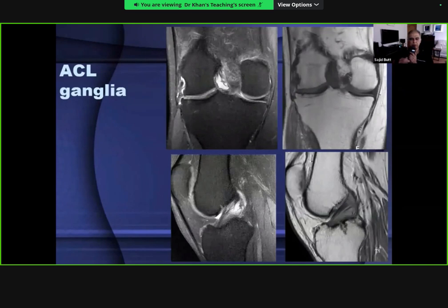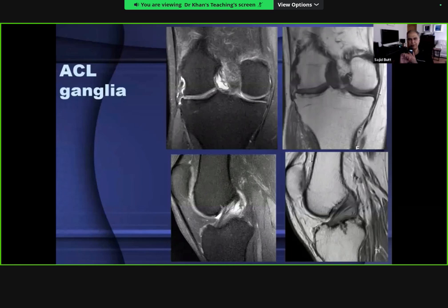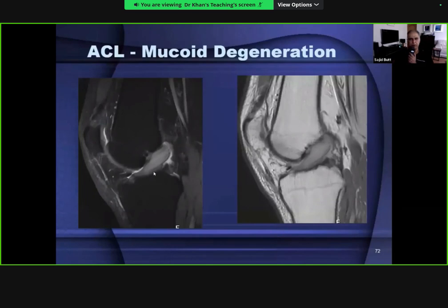Not everything with bright signal intensity in the ACL is a tear. An ACL ganglion cyst represents mucoid degeneration of the ACL connective tissue fibers, producing bright signal intensity that splays the ligament fibers. With mucoid degeneration the ligament fibers become swollen - this is called the drumstick or celery stick appearance. This is not a tear but mucoid degeneration of the ACL fibers.